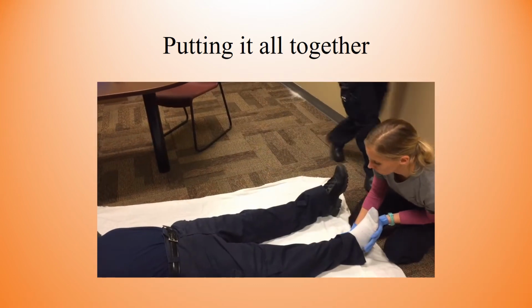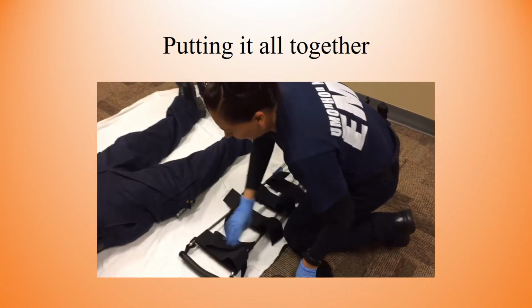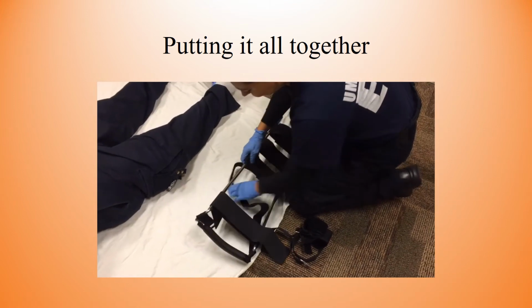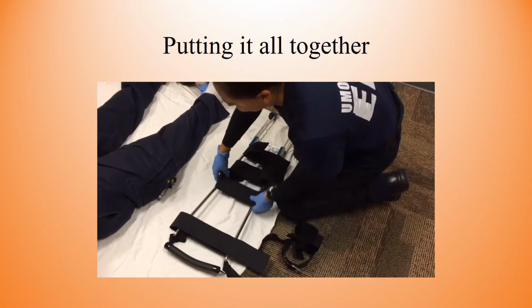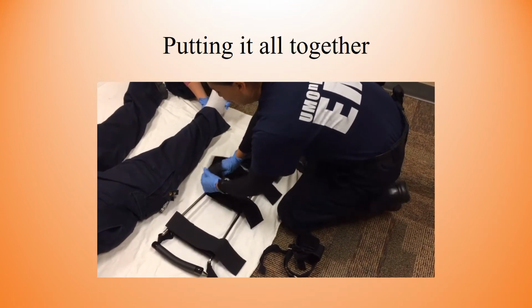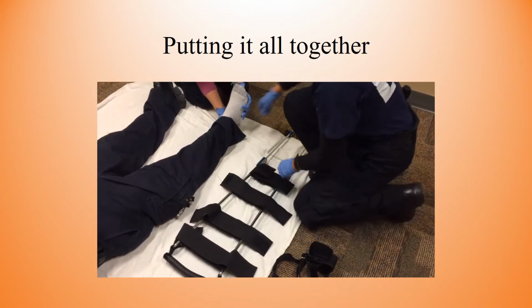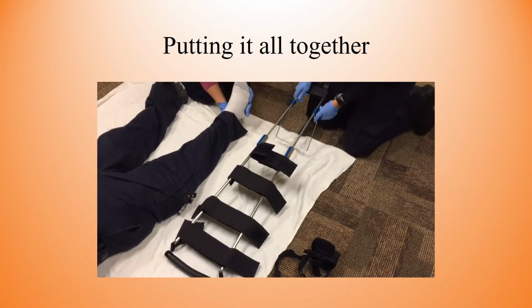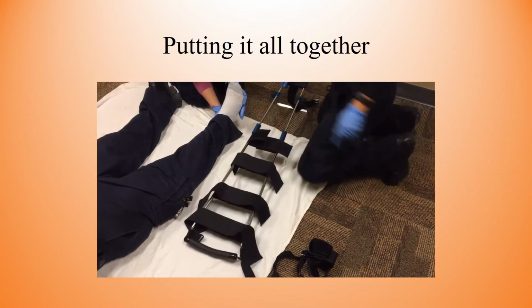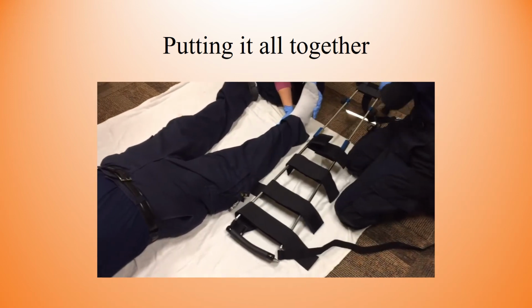All right, sir. We're going to put you in a traction splint today. Okay. Have you ever had one of these on your leg before? Never. Okay. Well, it's going to put a little bit of traction on you. Line up those bones so they're not overriding each other anymore. All right. I'm in a lot of pain though. I need something. All right. So we're going to go up under the leg, okay?